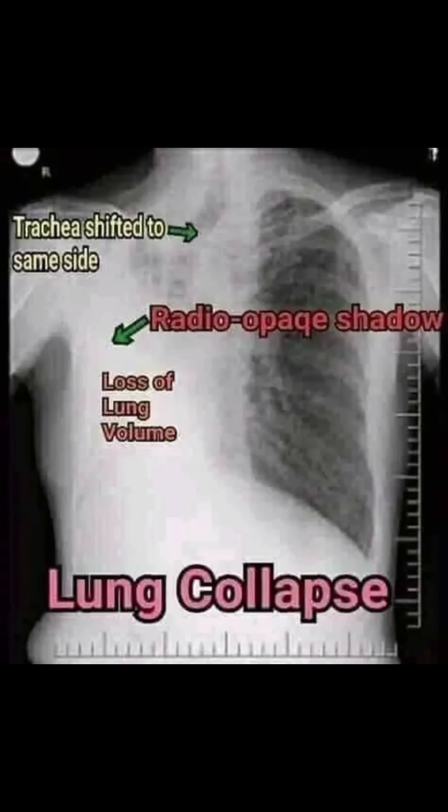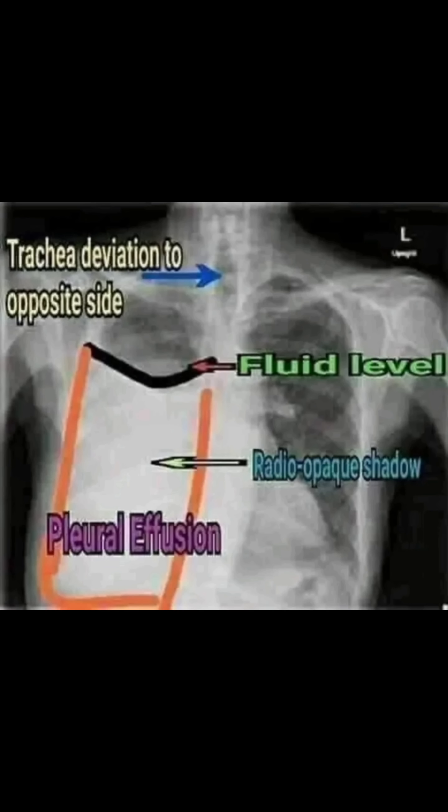In this, the trachea is deviated to the same side with homogenous opacity, suggestive of lung collapse.